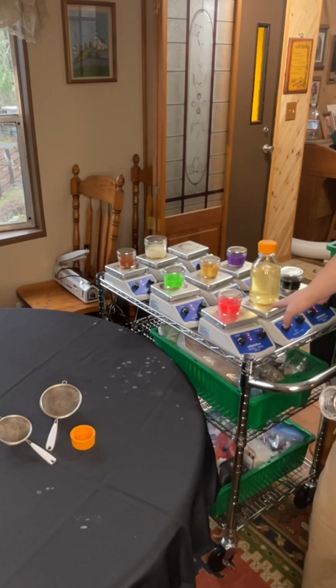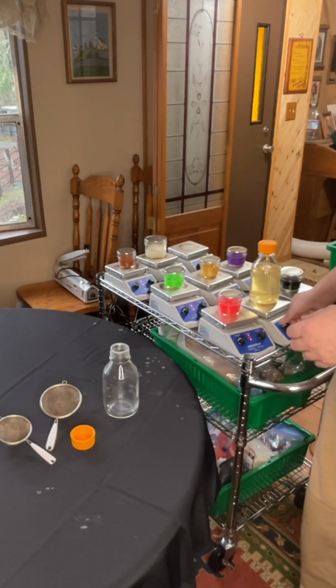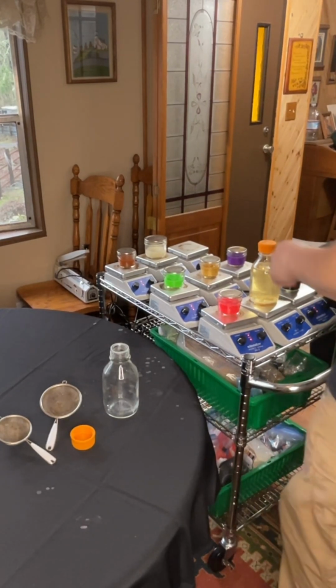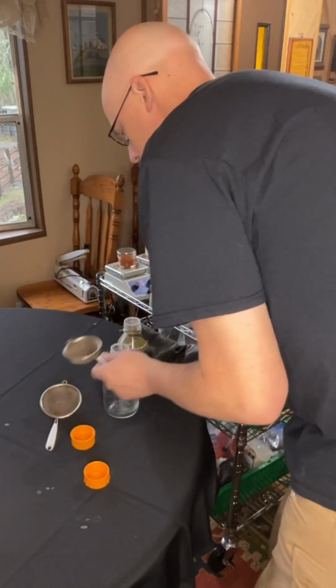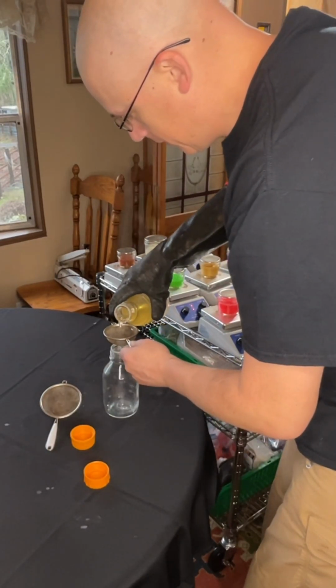I don't know how well you can see that, but it's almost boiling at the bottom. That's how I know it's time to go ahead and turn my stirrer off, take it off, and strain it out using our tea strainer here, but also using our fancy barbecue glove here. Now, obviously, you want to be careful when doing this not to get it on yourself or spill.